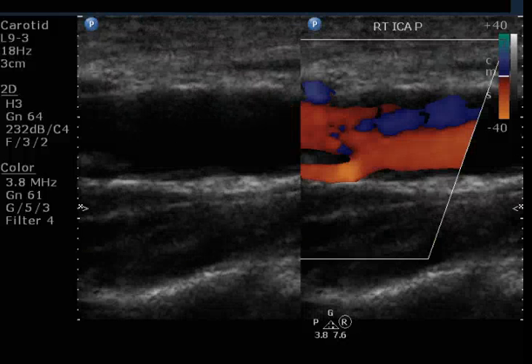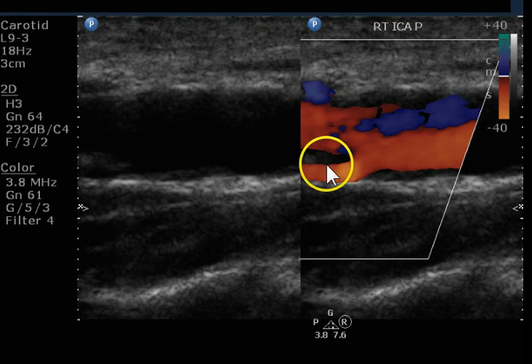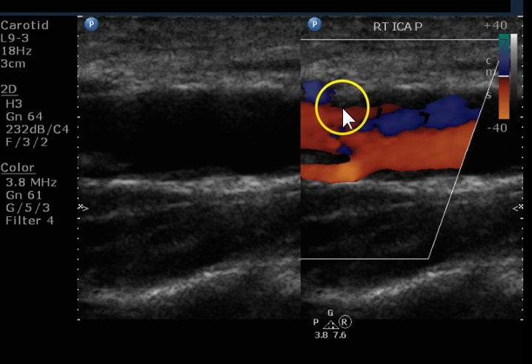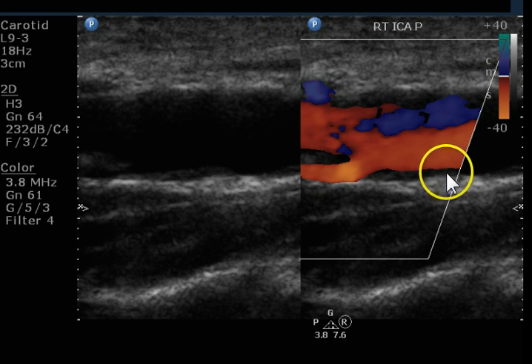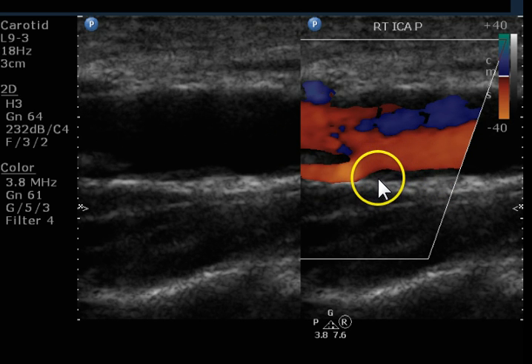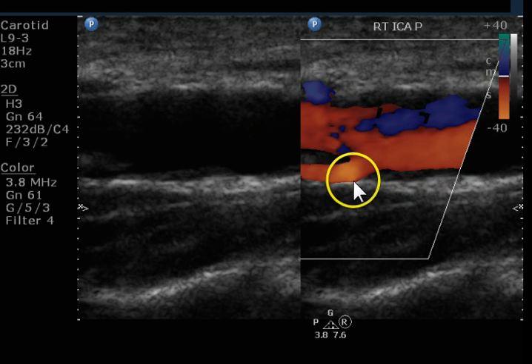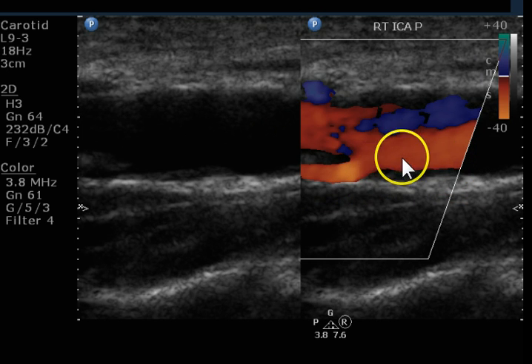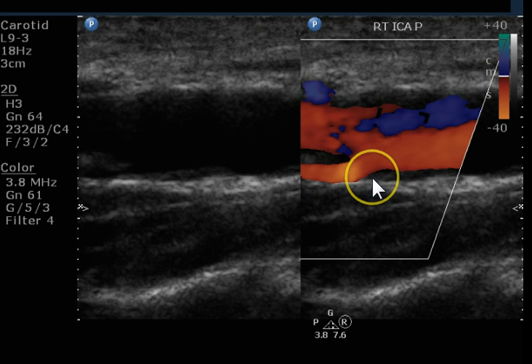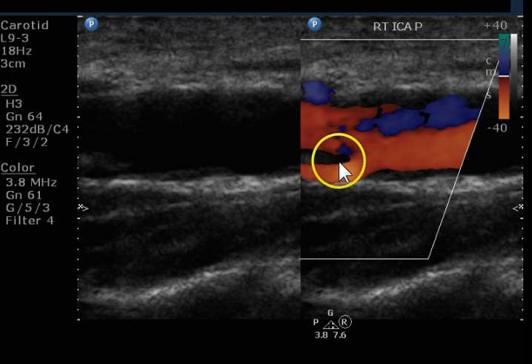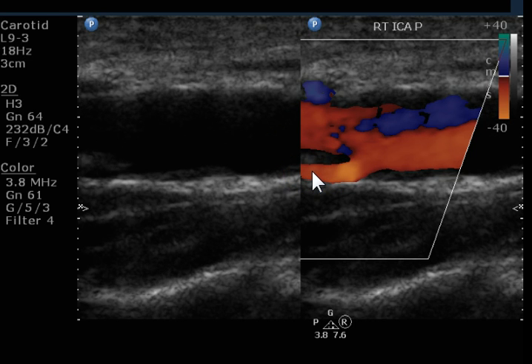Here we have the proximal ICA. We can see the division into a false lumen and true lumen at the area of the dissection. It's clear this is a dissection because we see the thickened intima at this location. Most dissections, unless they're traumatic, will have some thickened intima. We see the thickened intima here — it disappears, we get flow behind it, and here's the thickened intima with the defect allowing flow to create a false flow lumen in the proximal ICA.